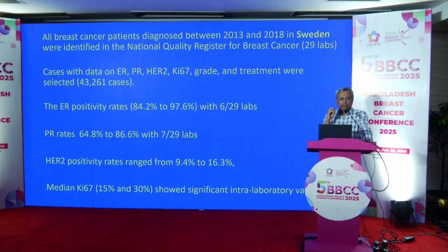So I think it's critical that all labs who do ER, PR, HER2, at least ER, PR, HER2, should check the trend over the last at least 1 year, 2 years. So if you do it every year, or every 5 years, then you'll notice any drift. So I think it's quite essential to know the positivity rates.